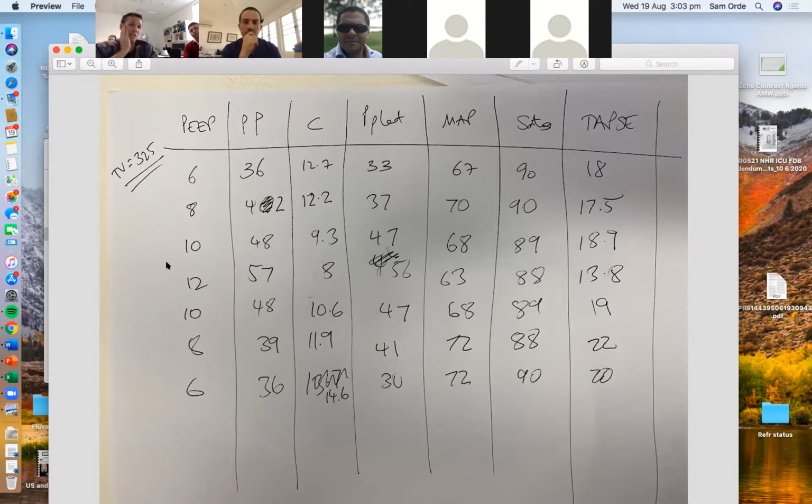Yeah. So maybe, I think this would be a really interesting study on patients like this. I'd love to get 10 or 15 of us, one after the other, going along and doing measurements of RV function. I bet our TAPSEs would all be different, which is why it's so important to try and have multiple measurements and put them all together. Yeah, I think again, this returns back to the physiology underlying. So whenever you are applying higher PEEP, there will be increased resistance across the pulmonary artery. And this definitely would compromise the RV function. So no wonder in this patient that they may not cope with this amount of increase in pressures. Yeah.